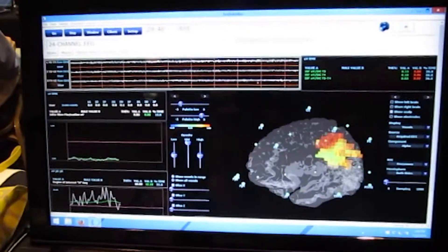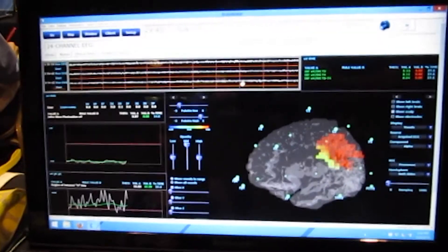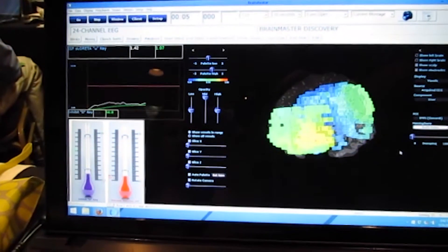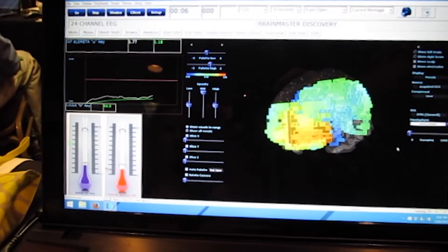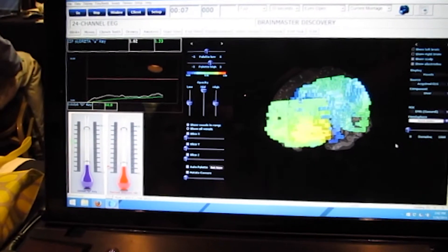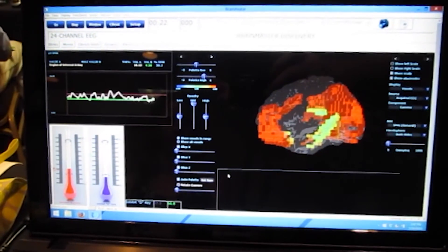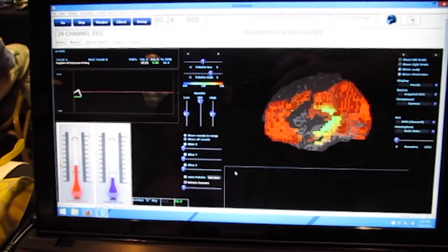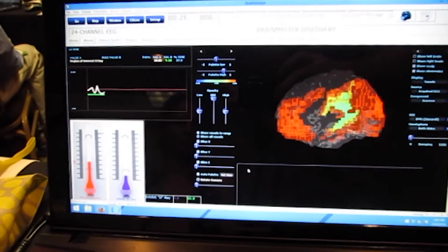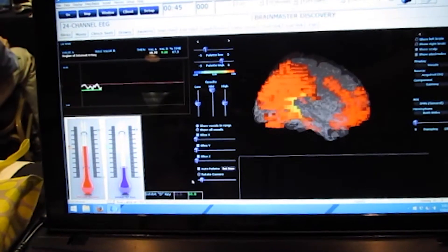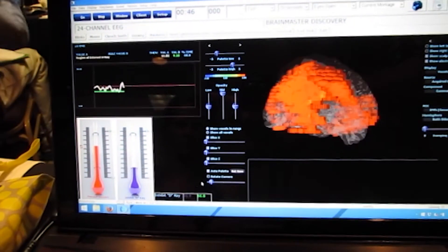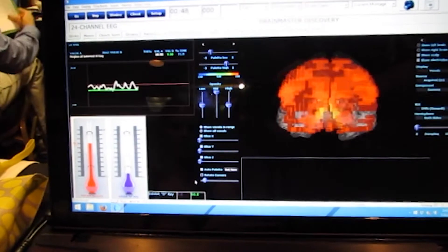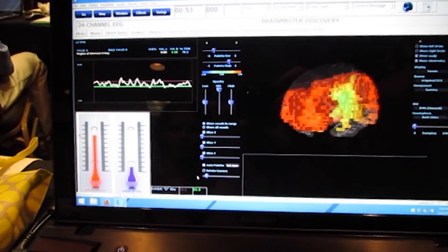Brain events are reflected on the screen in less than 30 milliseconds after they occur. However, it takes longer for a person to become aware of their own brain process. So by showing pre-conscious activity in real-time, this system is truly faster than thought.